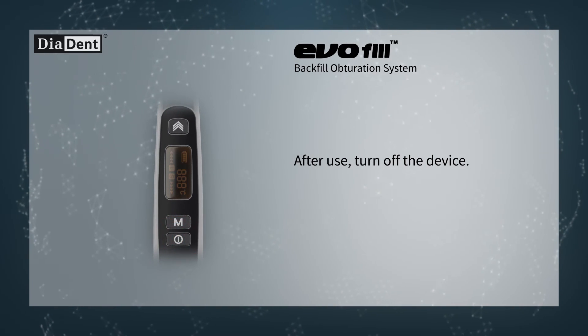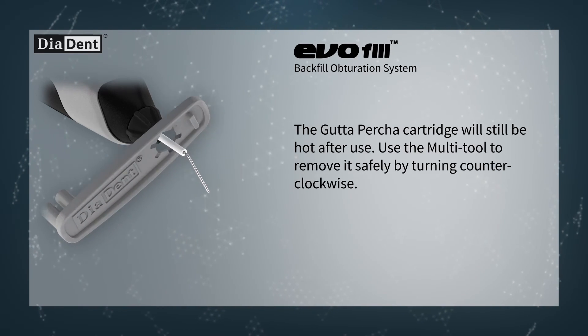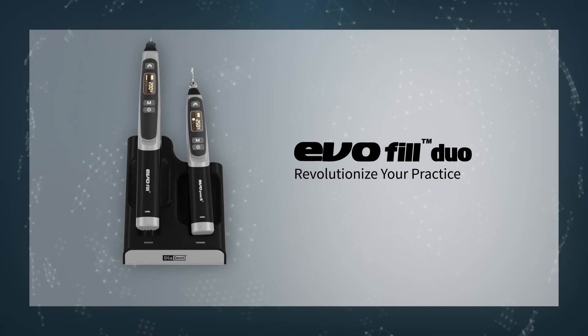The gutta-percha cartridge will still be hot after use. Use the multi-tool to remove it safely by turning counterclockwise. Evofill Duo. Revolutionize your practice.